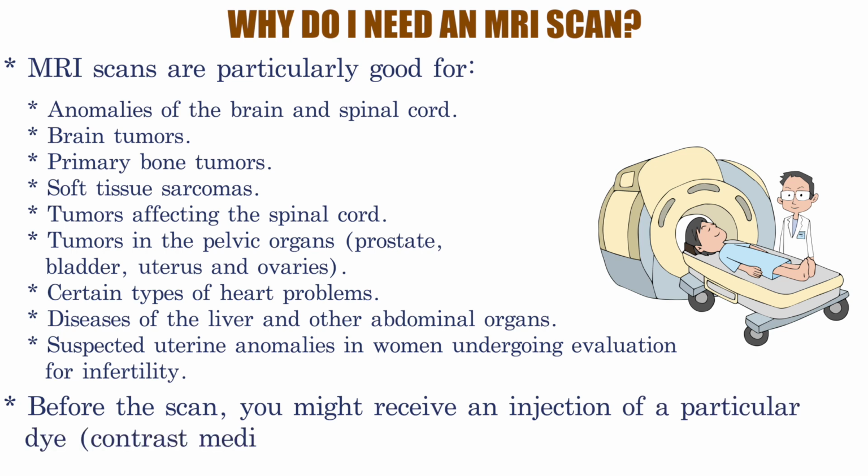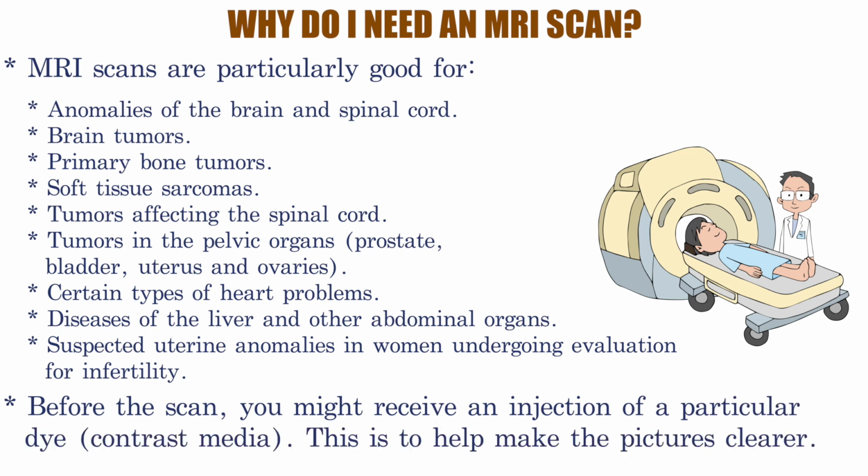Before the scan, you might receive an injection of a particular dye, contrast media. This is to help make the picture clearer.